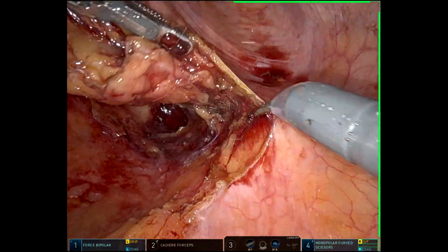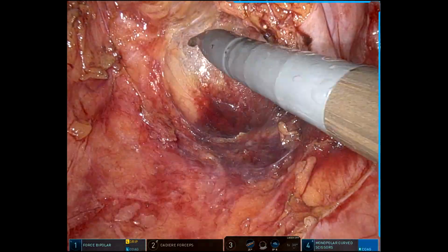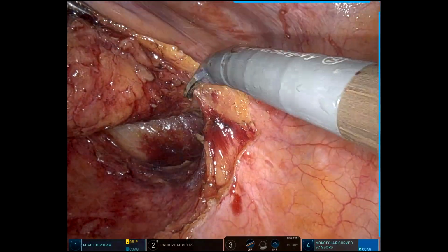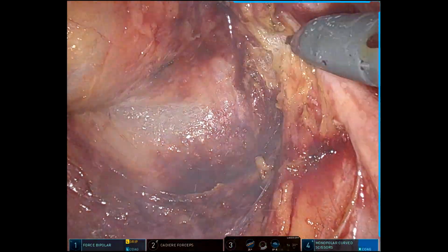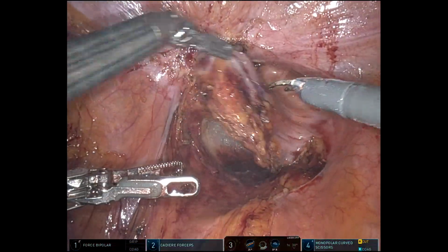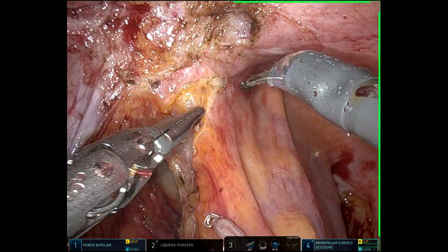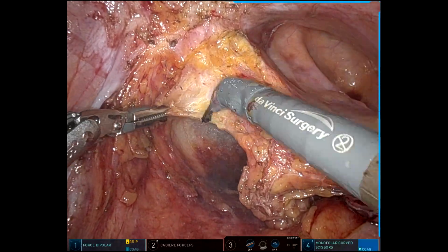This is a practice that I do more commonly when I'm doing transrectal extraction of the specimen because I feel like it helps mobilize the rectum for easier extraction. But I'll also do this in cases where I just want to get a few centimeters of reach and decreased tension. And this is, I think, another nice maneuver that you can do for reach, in the opposite mobilization than going up and doing the splenic flexure.